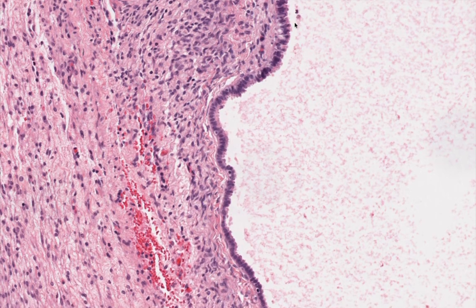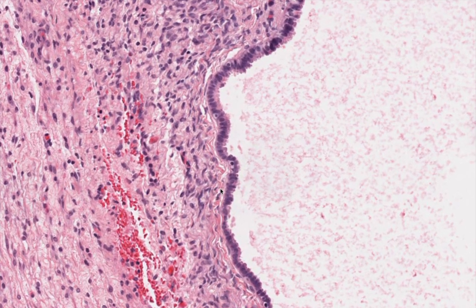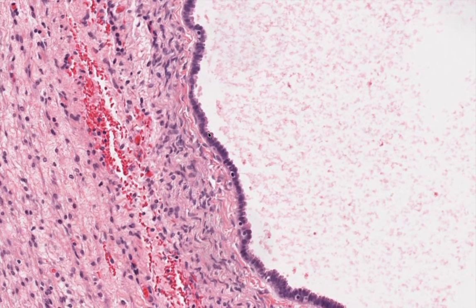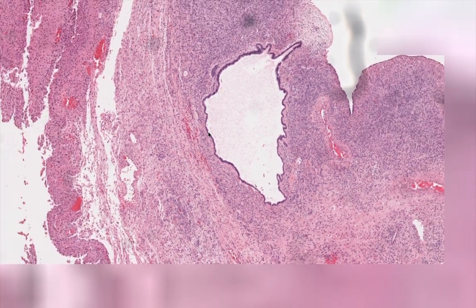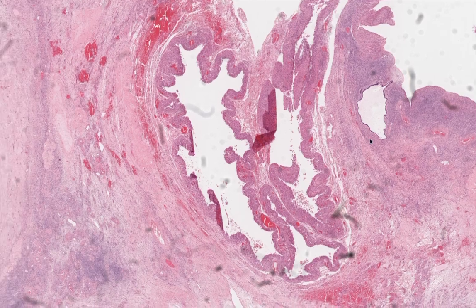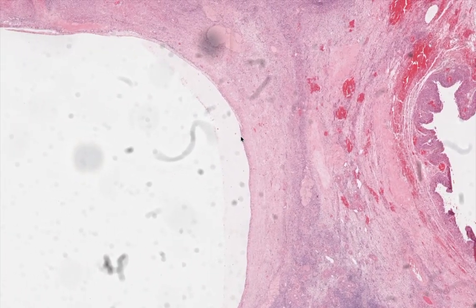If we look here closely, we might be able to see some cilia. We've certainly got some intercalated cells. So I think this is an epithelial inclusion cyst of fallopian tube origin. But that's also completely usual and normal in an ovary. So what else have we got here?